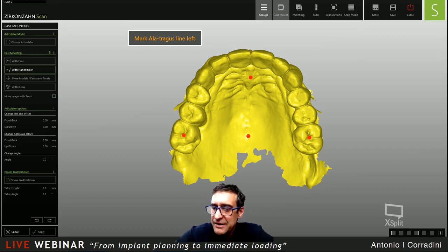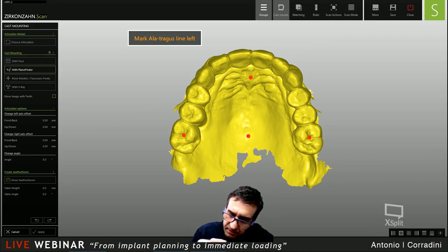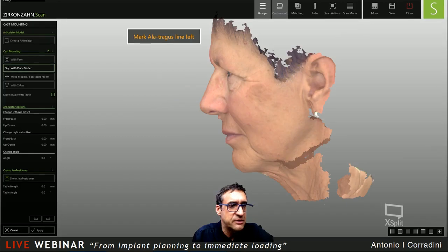It's not a deep course, and if you would like to be here or to have an online training, that can be, and you can go a little bit deeper in these data. But this is basically just to know more or less the possibility to mount the patient using the natural head position. So we have basically these 4 points.